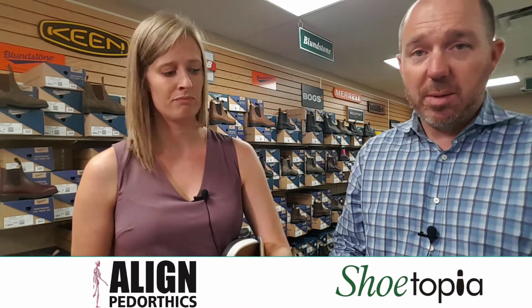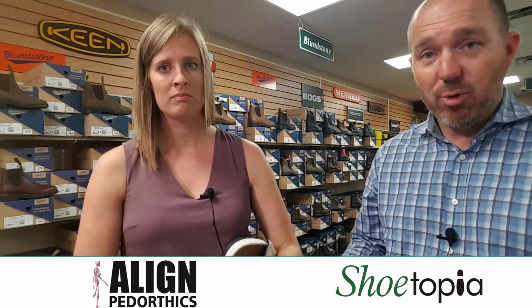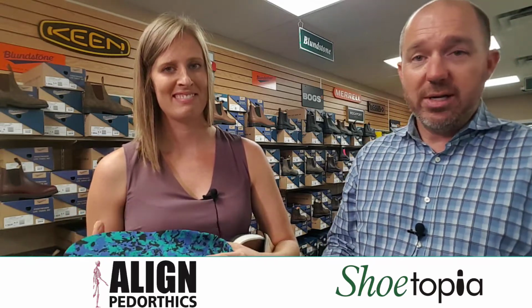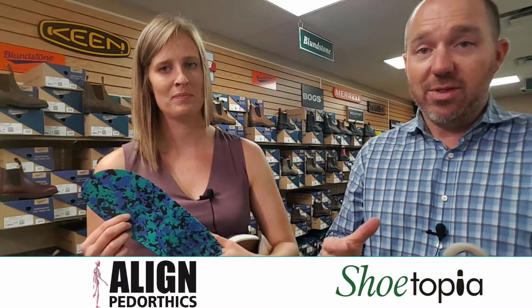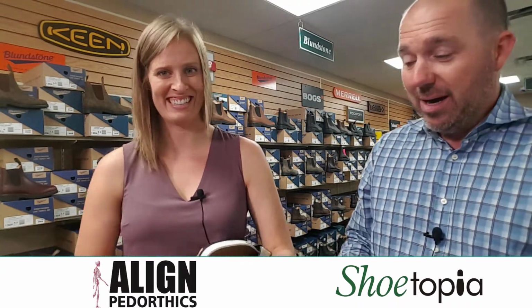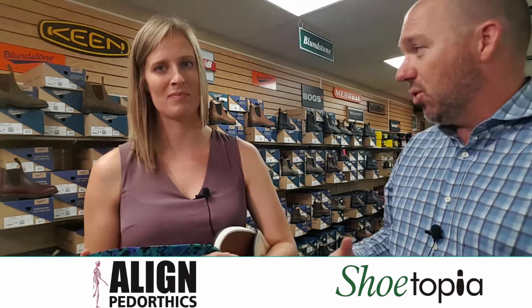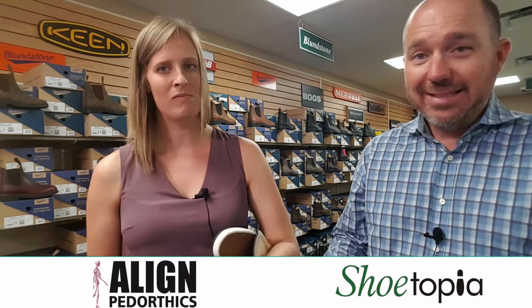Yeah, we certainly see people coming into our stores with maybe first time or even fairly new with orthotics and a piece like this and saying, well, I need to put it in my dress shoe or I need to get it into something else. But a lot of times they really just don't fit into some of the, let's call them, a little more refined type footwear. Yes. Great option for your running shoe and for your walking shoes and your work boot and all that sort of stuff. But if you're trying to take it to the wedding, it's a little tougher. So what can we use in those situations?